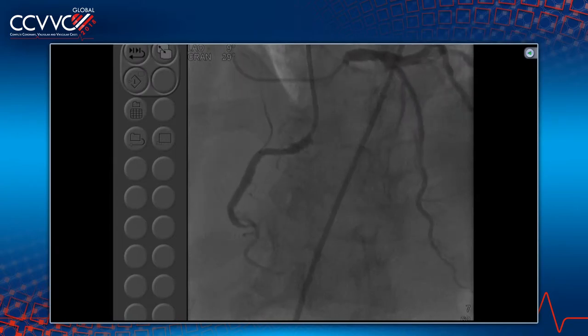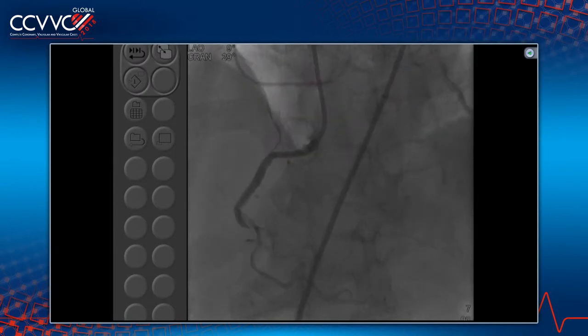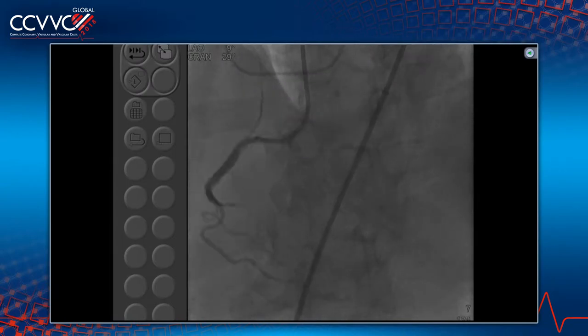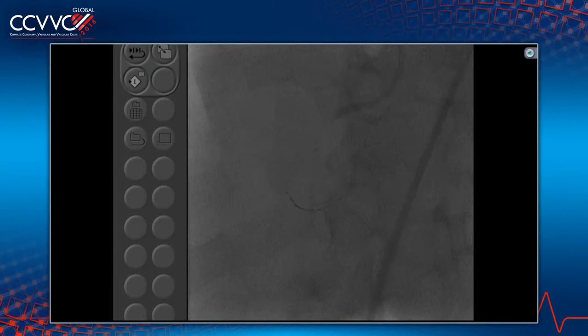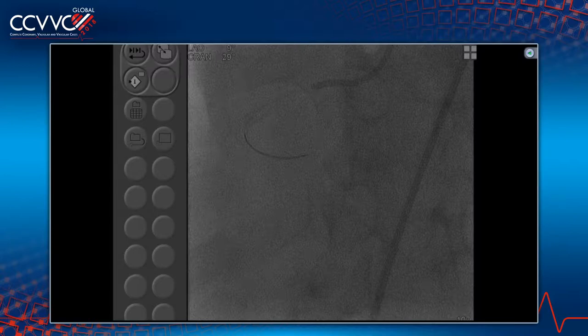Vessel. It's okay. It's just that the last film was almost 4 years ago, so we don't know when the occlusion happened. So here I am with the Fine Cross, and I think I'm hitting some resistance here. So I will change to wire escalation, I will change to the Gaia now. The Gaia family is the same thing as a new wire where they have a micro cone tip, and the tip already comes with a 1 millimeter pre-shaped tip.